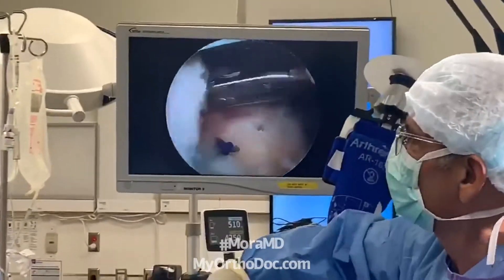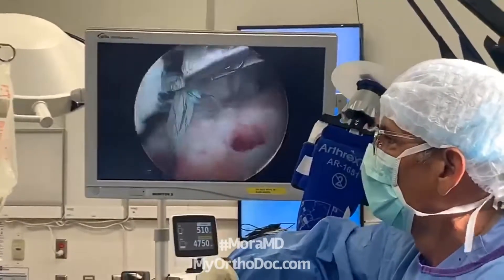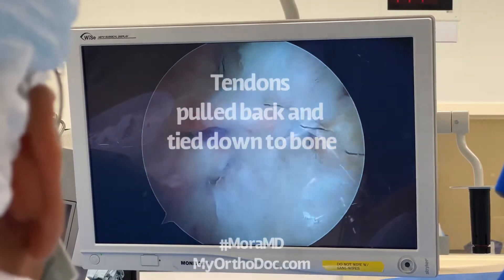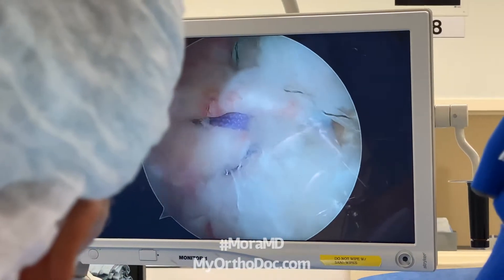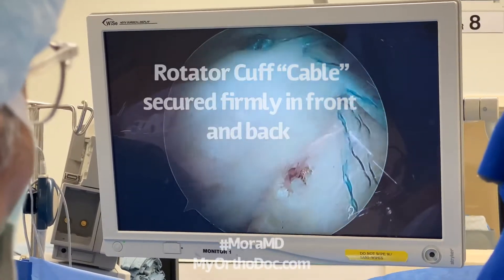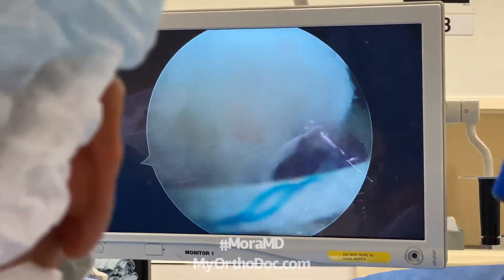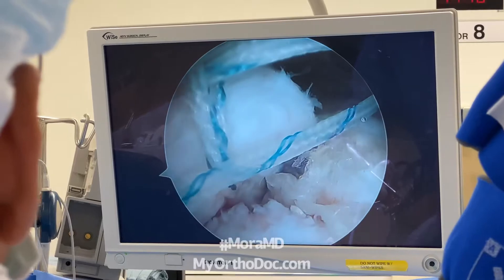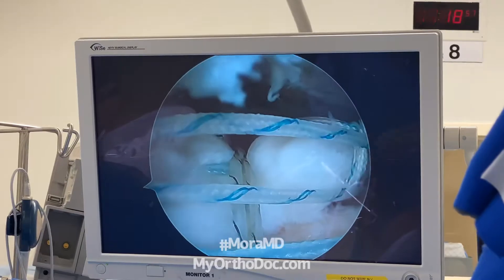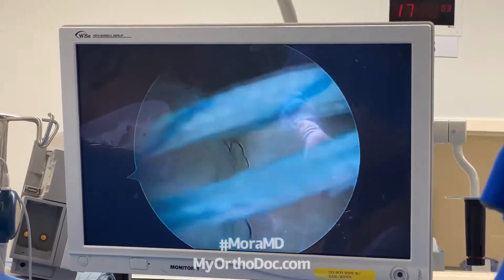Going back now to close down this rotator cuff tear — I put a Stryker Speed anchor in the back to fixate or anchor down the posterior aspect of the rotator cuff. Then we move way to the front, and there's actually another Speed anchor right there — you can see another Speed anchor holding the anterior aspect of the rotator cuff. I put a little clinch loop right there just to take down a dog-ear.